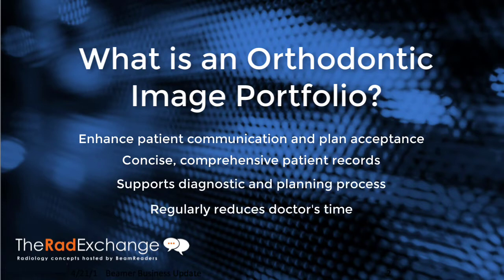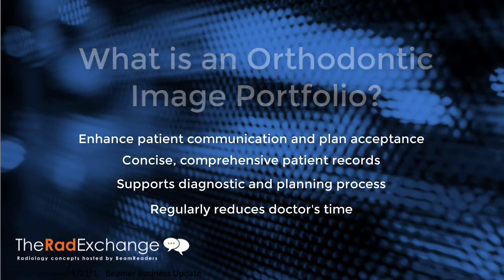I've been asked to talk about what is an orthodontic image portfolio. This is something that we do in our imaging centers every day and for beam readers. So I'd like to take a few moments to explain what this is.